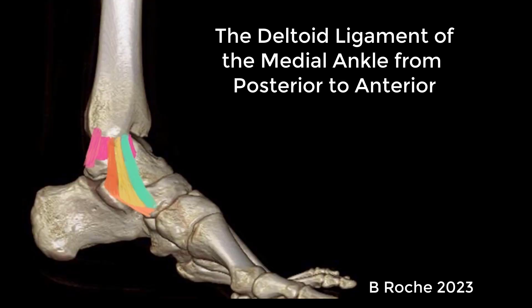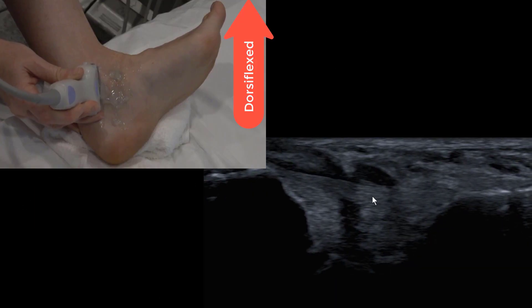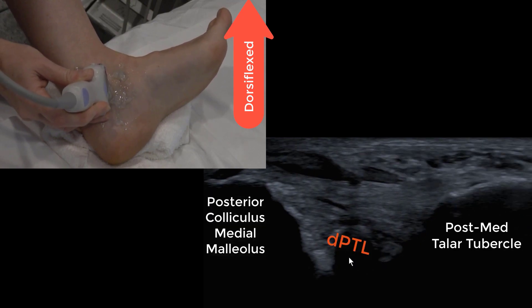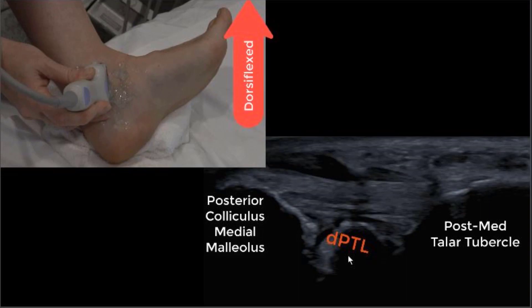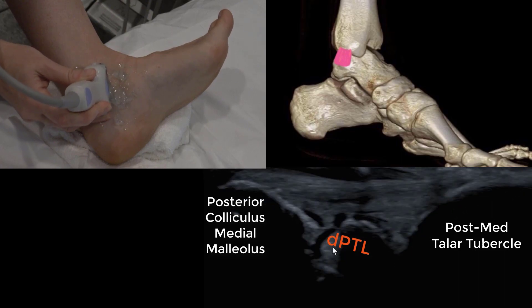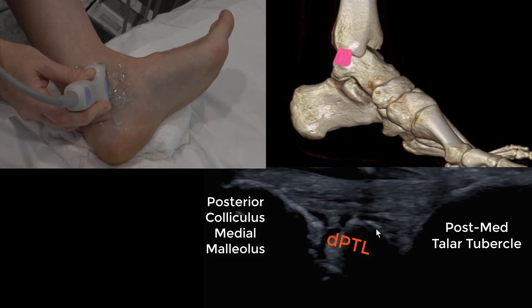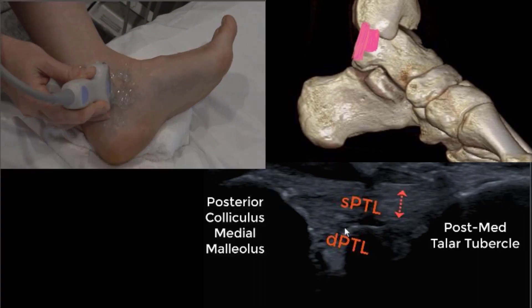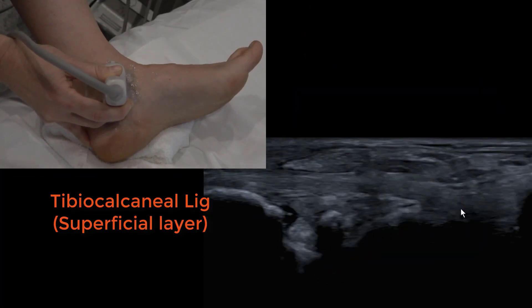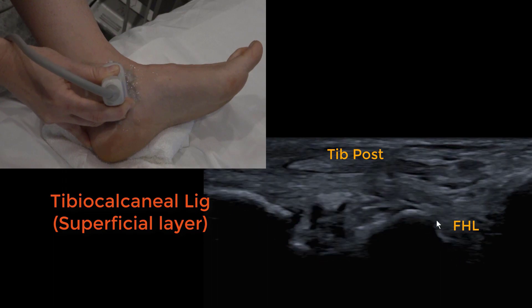Let's look at the deltoid ligament with ultrasound. The posterior aspect is best seen dorsiflexed. We have our probe on a diagonal from posterior colliculus to the centre point of the heel. The deep posterior tibiotalar ligament is occupied by a bony ossicle here. There may or may not be a superficial posterior tibiotalar ligament over the top, but you can see the talus clearly on the right hand side of the image.